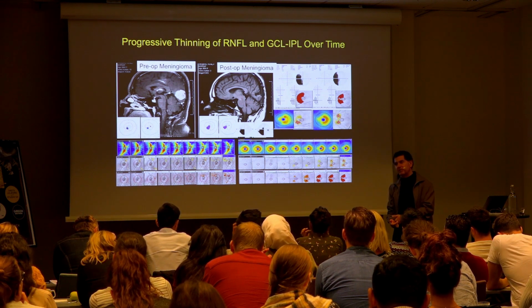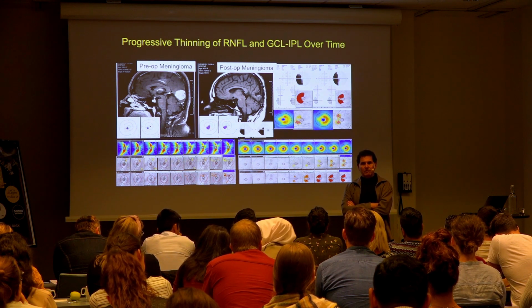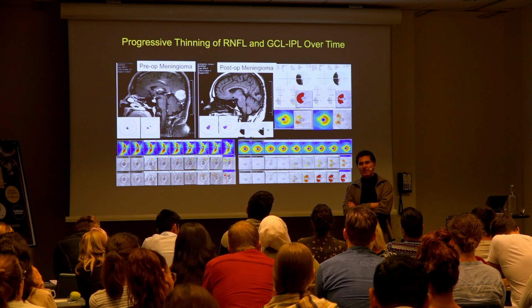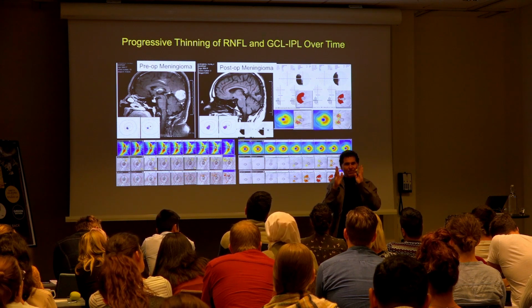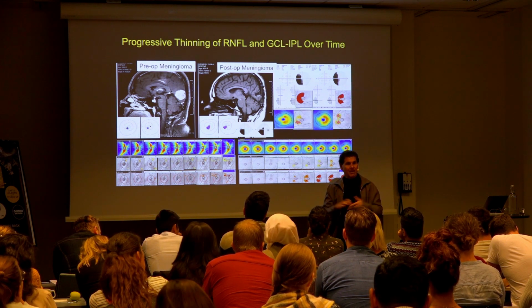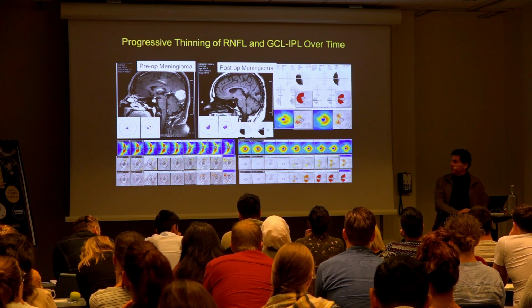The reason that has some importance is think about MS, for example. A lot of the population studies in MS and OCT show thinning of the ganglion cell layer, even though they're asymptomatic and never had optic neuritis. And some of those patients probably have had demyelination on both sides post-geniculate, and you can't appreciate that it's a bilateral homonymous, but it looks like diffuse loss. So some of those patients have had previous optic neuritis. Some of them may have had demyelinating lesions in the visual radiations, in the white matter there. So it helps explain some of these things that are being seen.